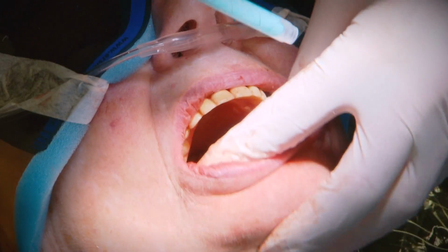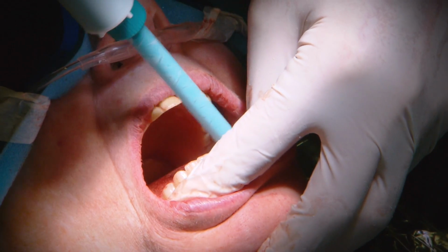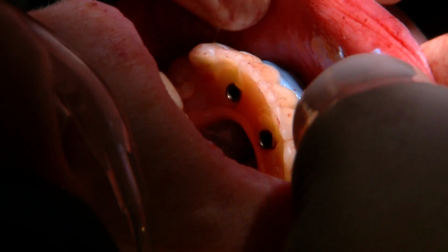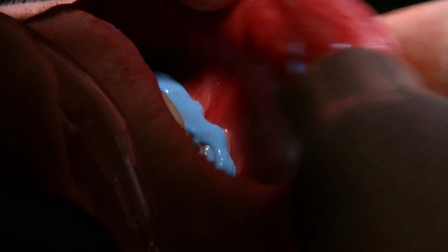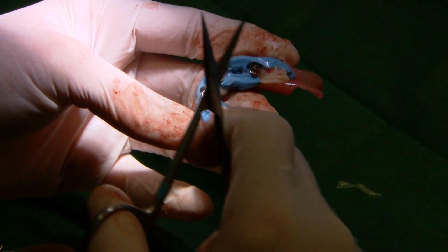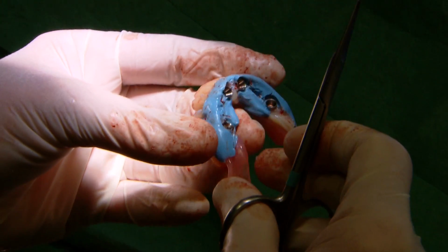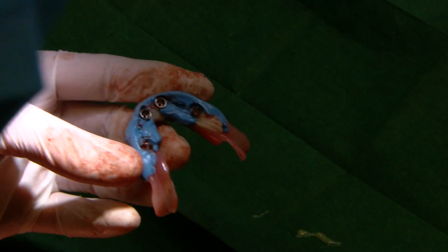Good. Next thing we do, we need an impression, to be taken around the underside where everything's changed. So remember, it's really the underside of this that the technician will be doing most of the work on. It's all the bits that we've changed with the surgery. So what we've done now is taken an impression of what's actually underneath the bridge. The bridge has been connected to these cylinders. This now all goes off to the dental technician to fabricate the final bridge.